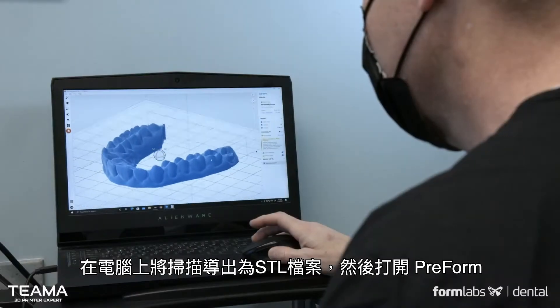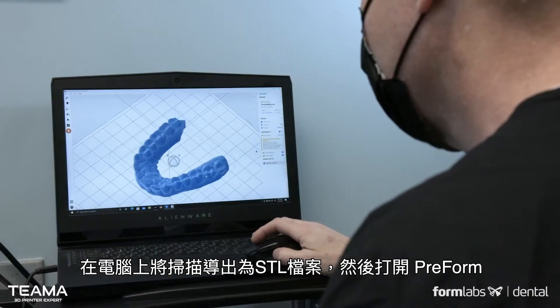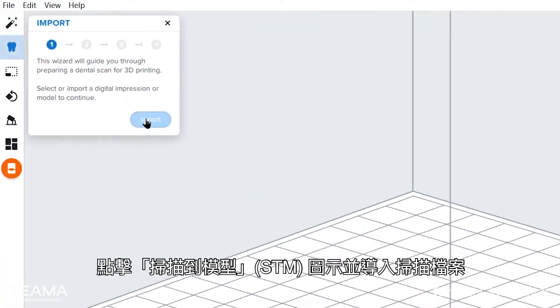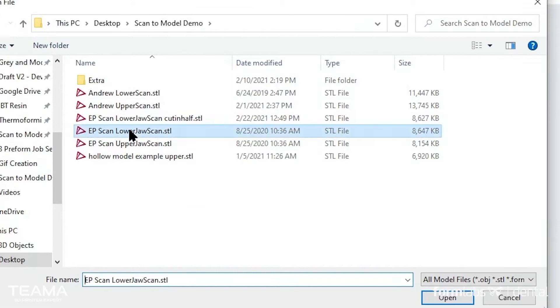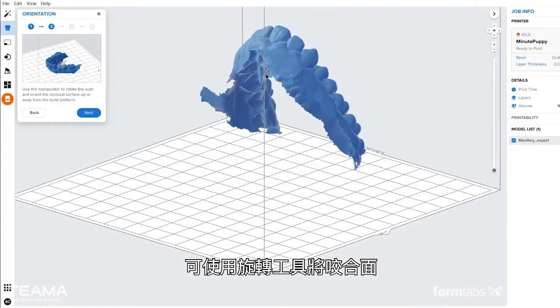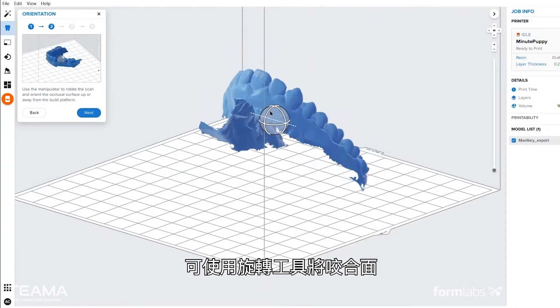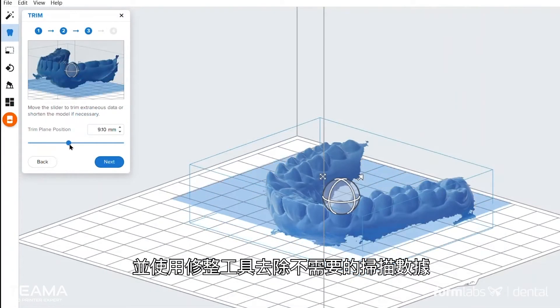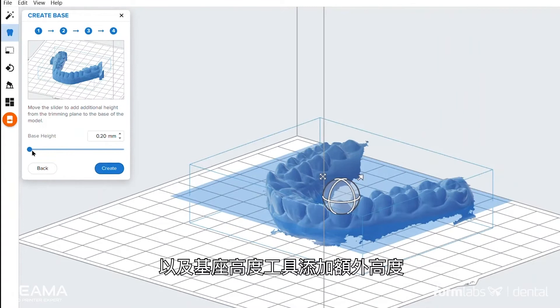At the computer, export the scan as an STL file and open PreForm. Click the scan to model icon and import your scan file. Use the rotation tool to position the occlusal surface away from the build platform, the trim tool to cut off unneeded scan data, and the base height tool to add extra height if needed.